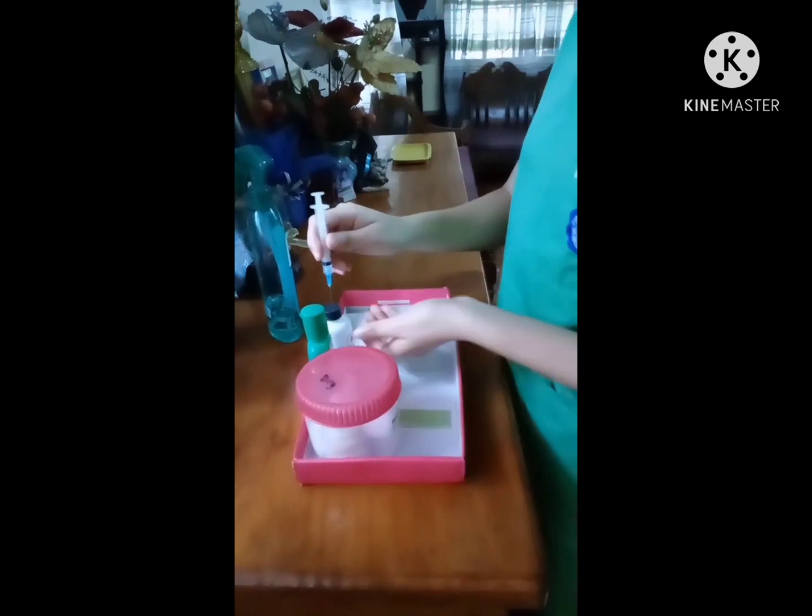If necessary, withdraw medication from an ampule or vial as described in the previous skills.